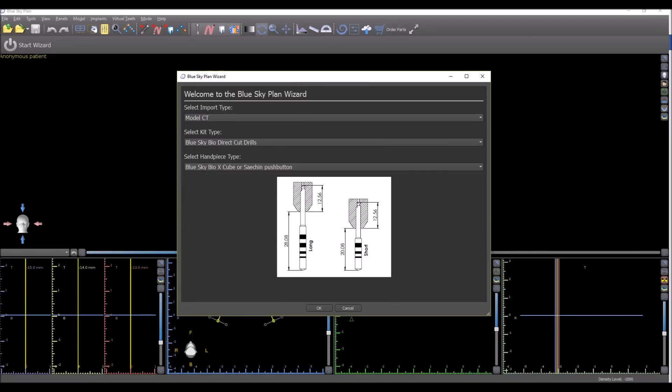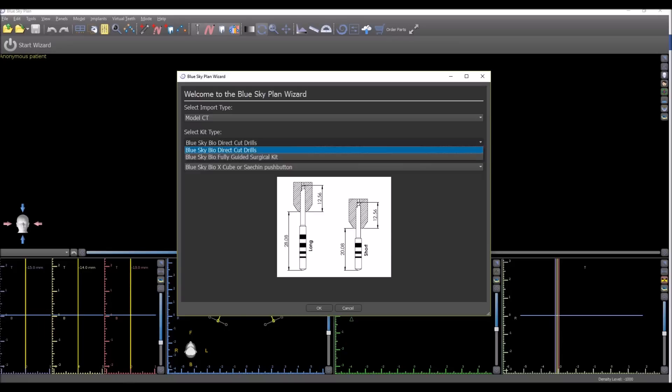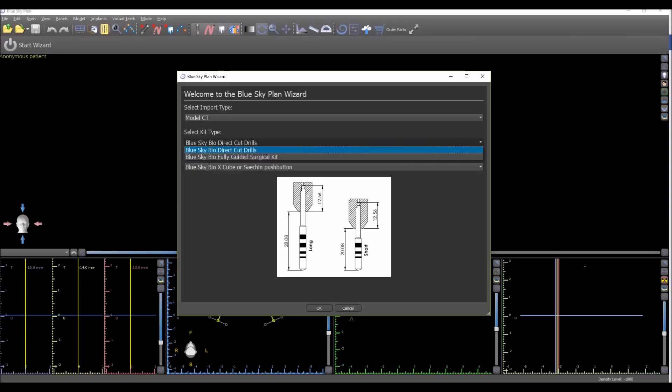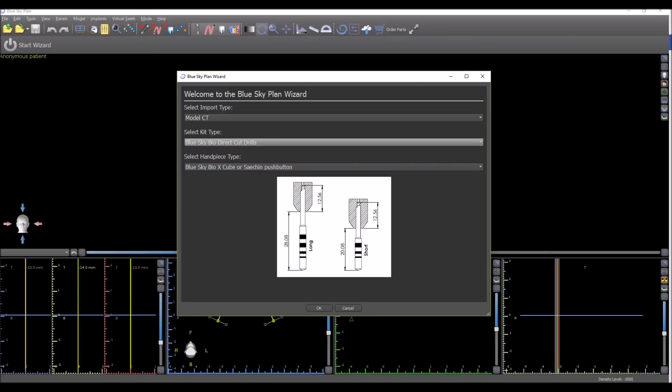In addition, this version of the software now supports multiple surgical guided kits. So you have the option to select which kit you're going to be using. We have the direct cut drills and we also have the new Blue Sky Bio fully guided surgical kit. And again, the Wizard, including the parts it recommends, including the report that's generated at the end, will modify itself depending on the selection made.